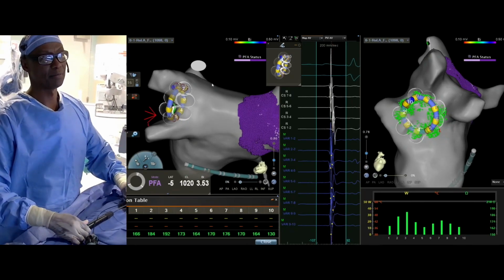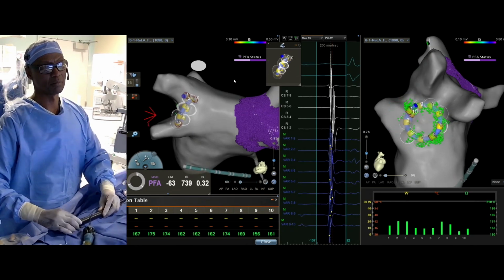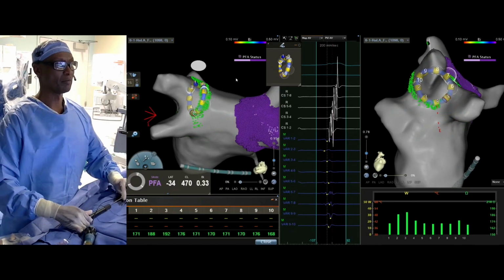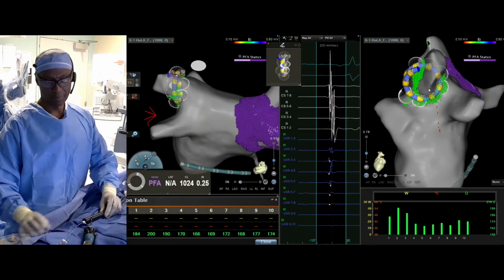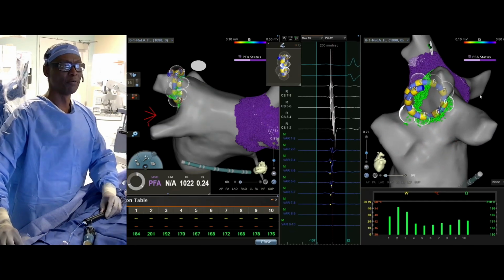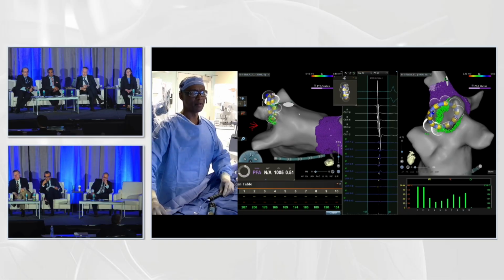Yeah, no, it sounds good, Charles. Yeah, please go ahead. I'm just going to ask the panel a couple of questions. Maybe, Luigi, I'll start with you. You've obviously had a bunch of experience with this catheter, and one of the things we're all aware of was that there was some... We're just going to go ahead and begin our first application here. Yeah, please. Why don't you do this, and then we'll continue our discussion. Go ahead with the lesion.